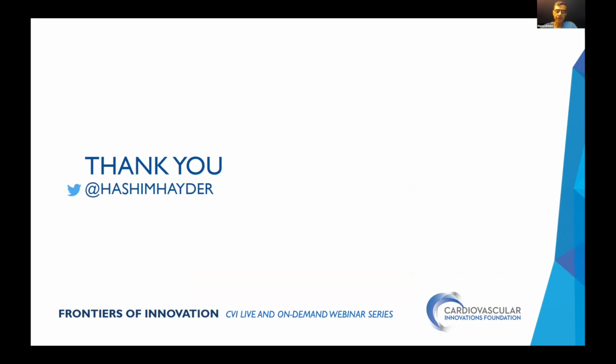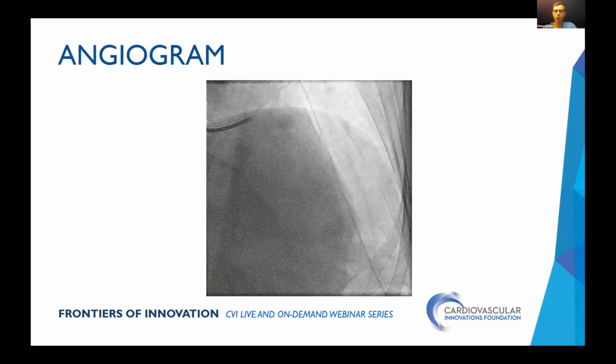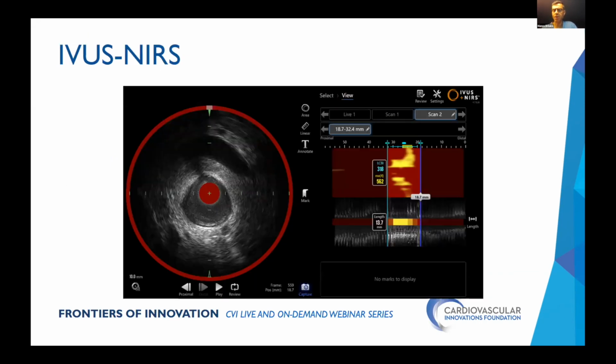Oh, this is perfect. Thanks. Actually, I think this is probably the most characterized patient in the U.S. for this year. I mean, it's amazing work on getting the full imaging, physiology. Pretty amazing work. And I think many people are not familiar with near infrared. We've worked with it for a long time, but I think it's become much more popular now, and that can really help you with lipid assessment, as can OCT.